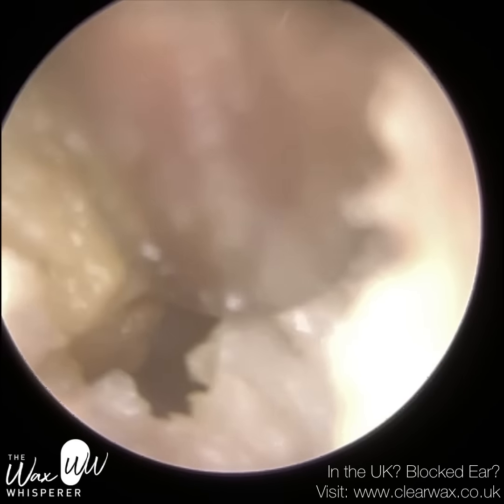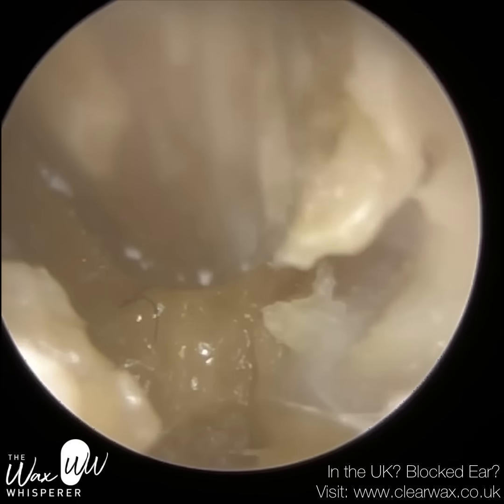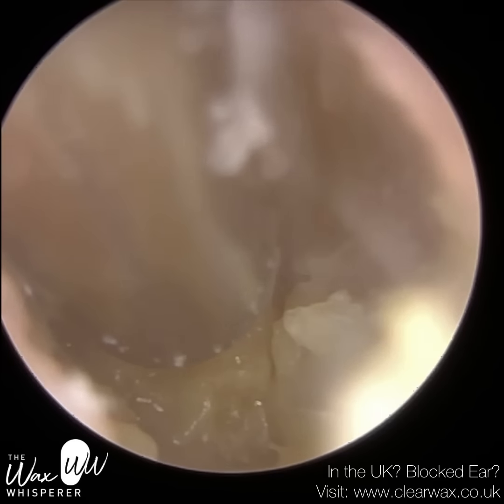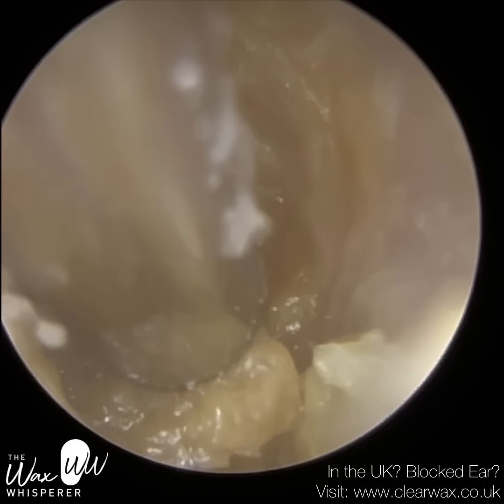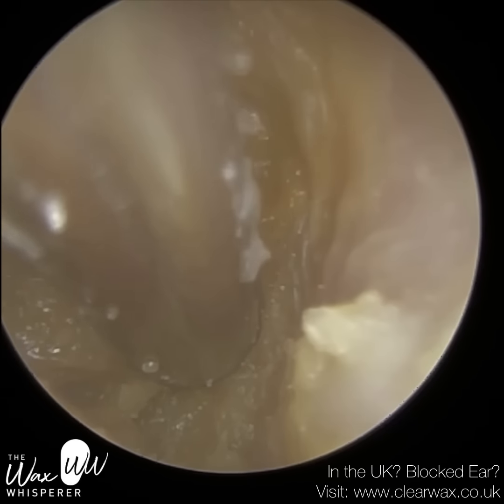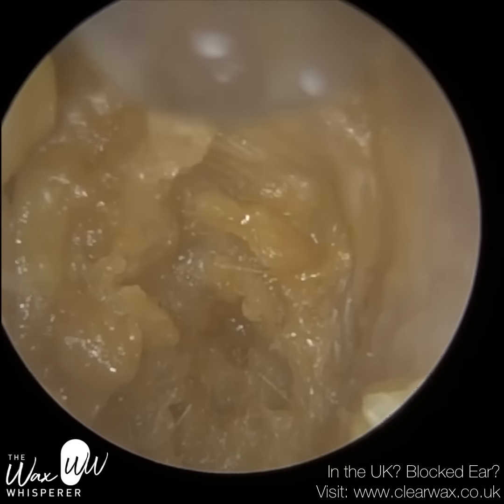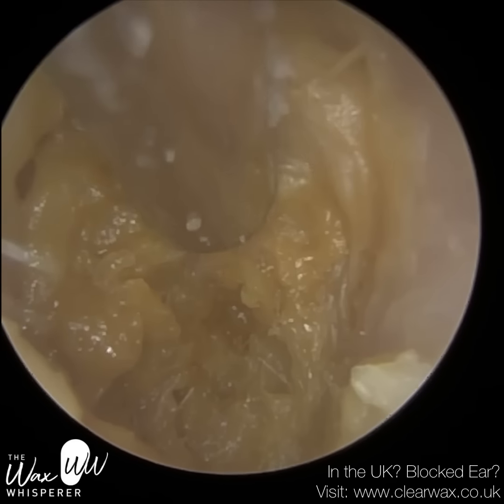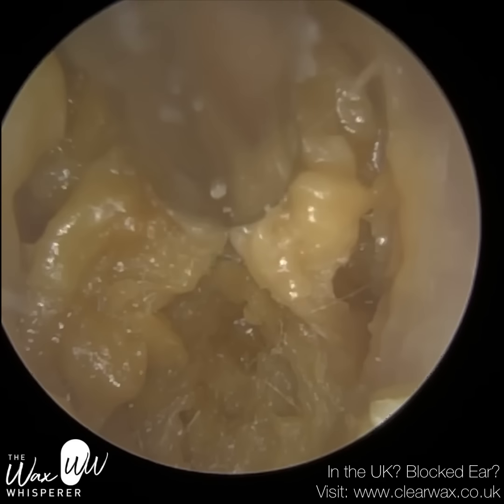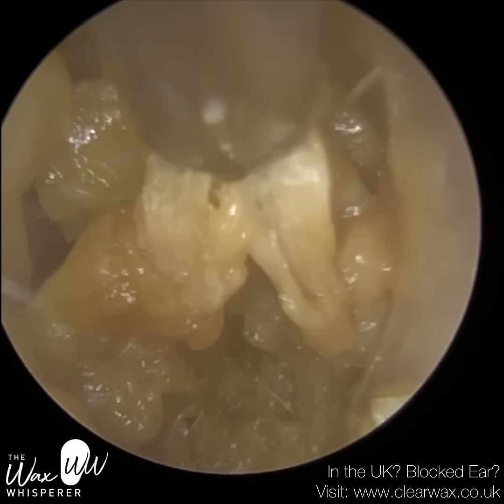Just stretching the ear open, and once you get in there, the ear canal does widen — you've got a much better view. I'm trying to clear the wax as we enter, so it doesn't reflect and doesn't blur the lens of the endoscope. If you look carefully, you can actually see all the dead skin and its structure — it's almost like ribbons. You can see how it's coiled upon itself. Dead skin is quite elastic.